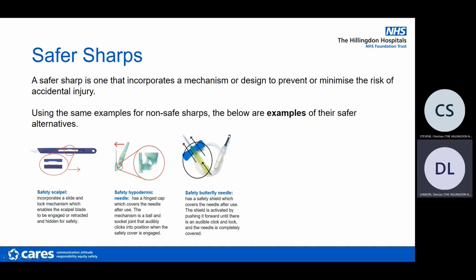You know that by seeing this little end here, but you can also find versions that you can use with a syringe as well. But the important bit is the safety mechanism. So butterfly, the winged cannula, which we talked about earlier, we can have non-winged versions of these as well.